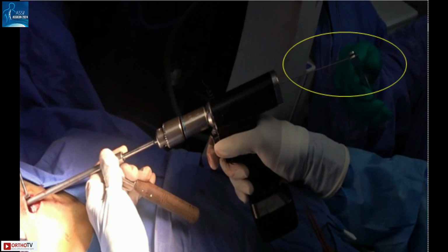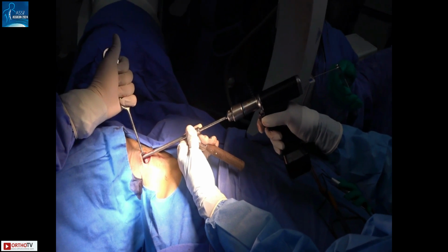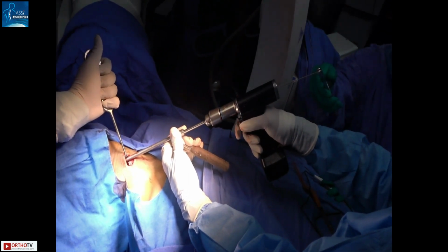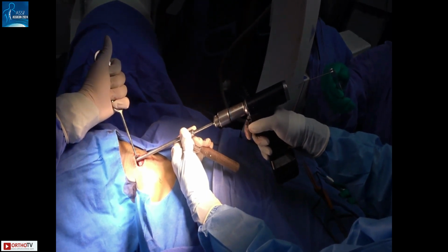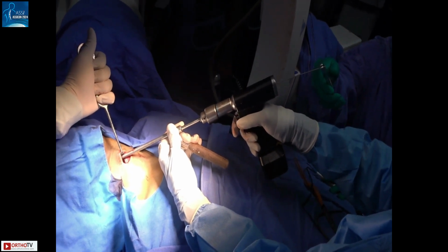But as you can see in the circle, your assistant has to hold the guide wire throughout so that when you are drilling it doesn't migrate across. That's a very, very important step. This holding of the guide wire when you are drilling forward and also while removing is crucial. While drilling forward, it prevents the forward passage of the guide wire. While you are withdrawing, it prevents the backing out of the guide wire.